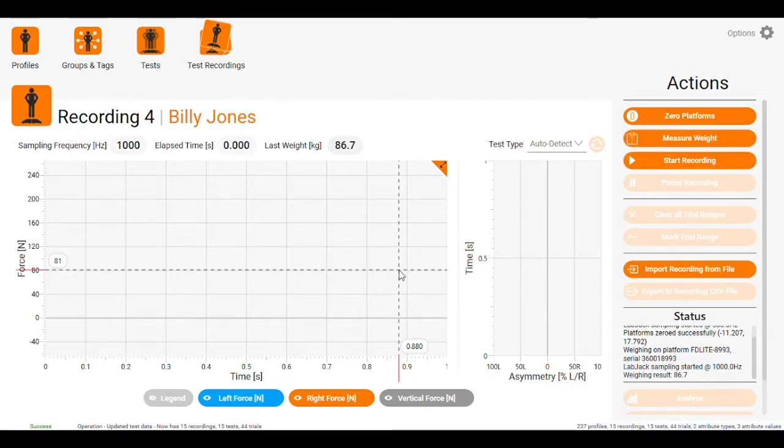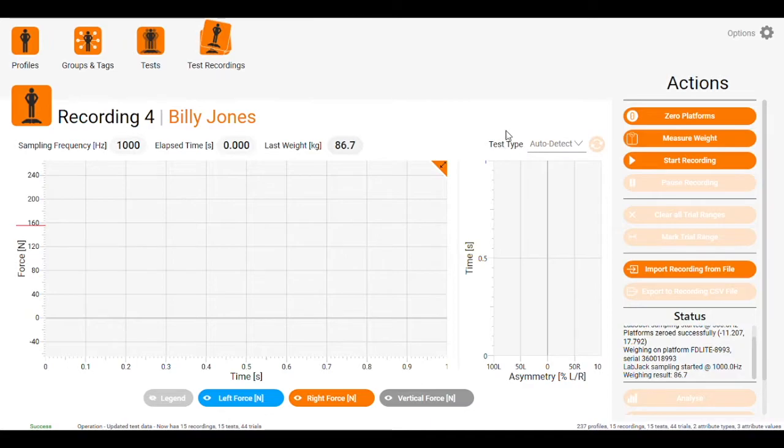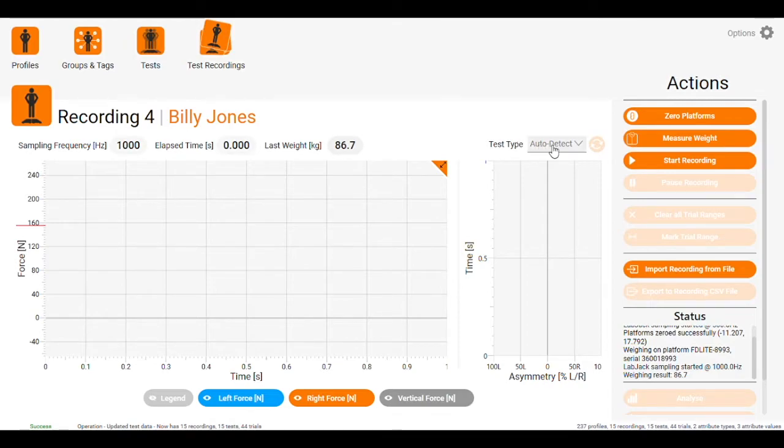Depending on the test, we can come up to test type here. For any jumping test, we can just leave it as auto detect.